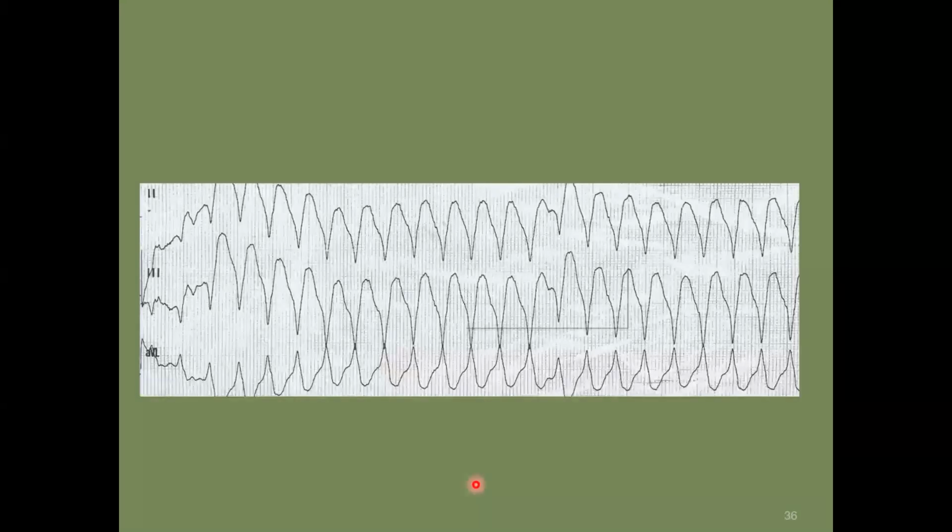If you see that on the monitor, that's when your eyes get big. Yeah, I love that. Yikes. We probably say that too, right? So until proven otherwise, we're going to call this VTAC, all right?